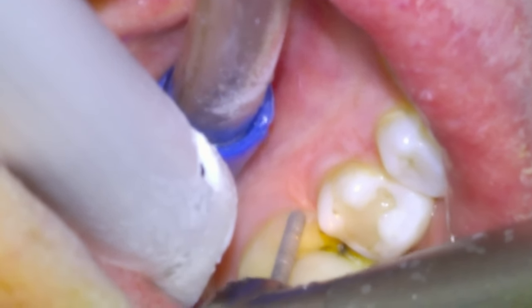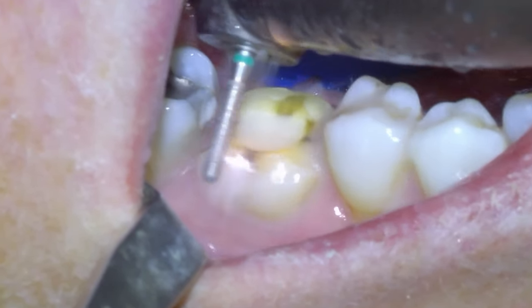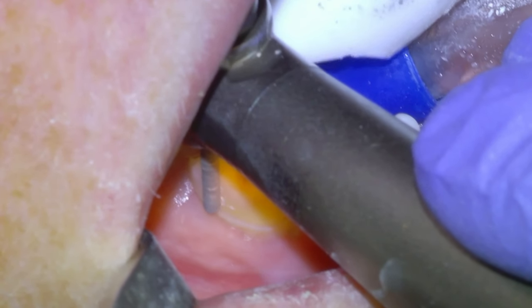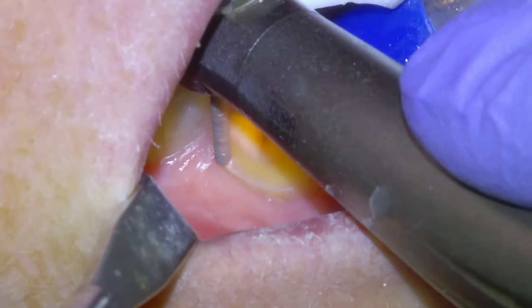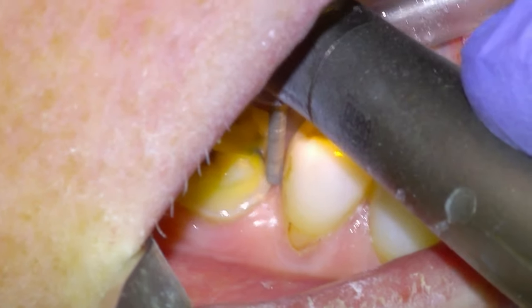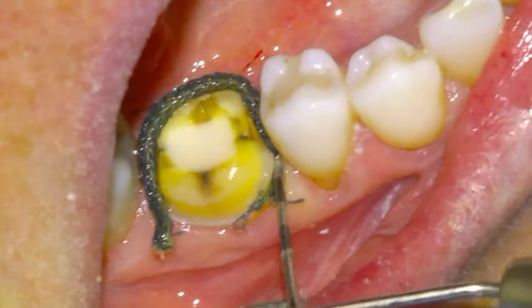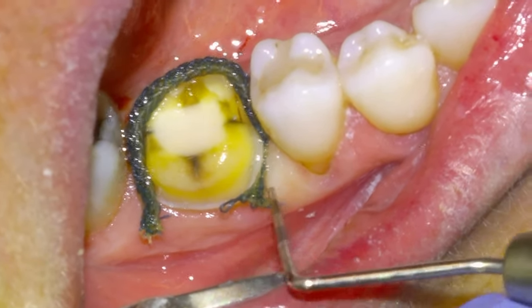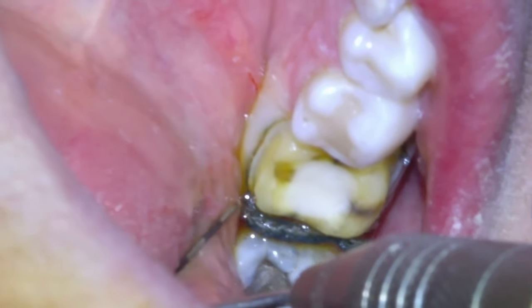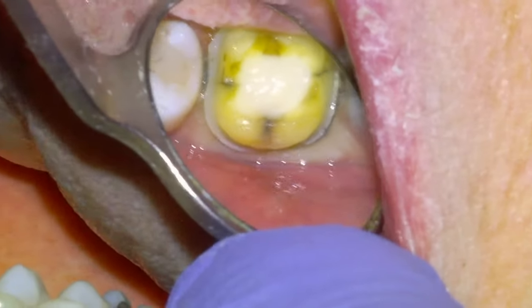We would have taken a preliminary impression at the beginning of the appointment but I don't think that was captured on the footage, so we're going to do a standard crown prep with a KS-1. We're going to leave the buccal margin half a millimeter supragingival and everything else equagingival. You can see that the crack doesn't really go through the distal enamel or the mesial. So we gave the tooth a pretty good prognosis and it's still in the mouth — I've followed up on this, it was probably about six months ago, doing well and asymptomatic.